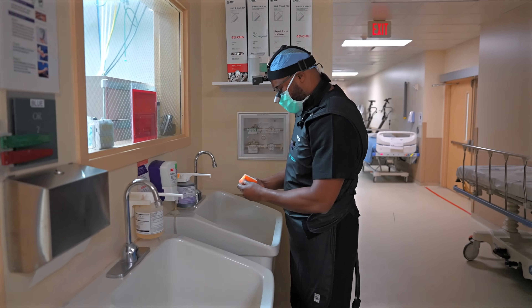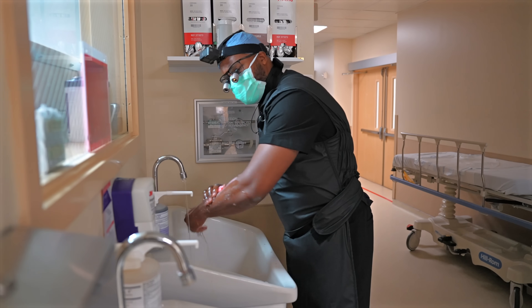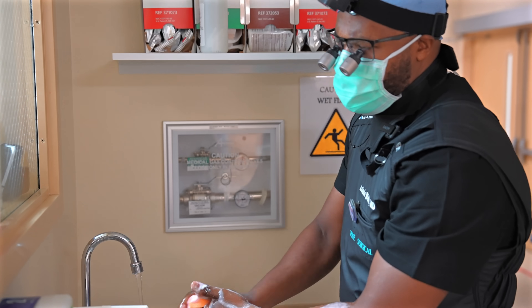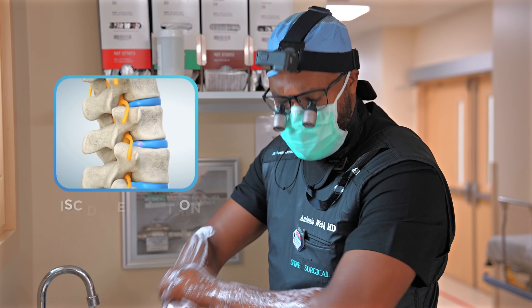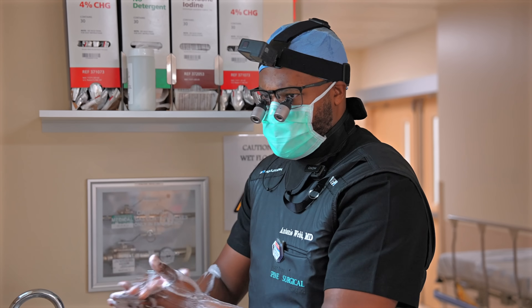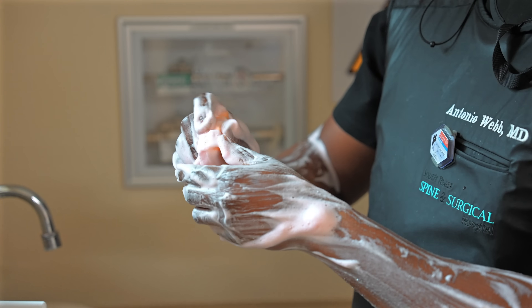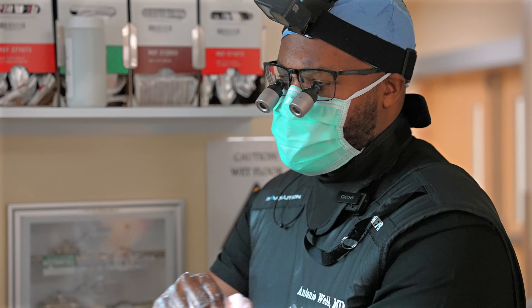Lumbar disc replacement is a great surgical option for patients that have back and leg pain. It has really strict indications — it's usually a younger patient that has minimal arthritis, what's called disc degeneration disease. The cushions in our low back and our neck, throughout our spine, don't really last forever, just like the tires on your car that need to be replaced. So it's very similar to a knee replacement or a hip replacement where we're replacing the parts. We're doing the same thing today.